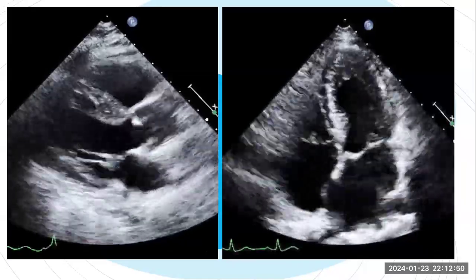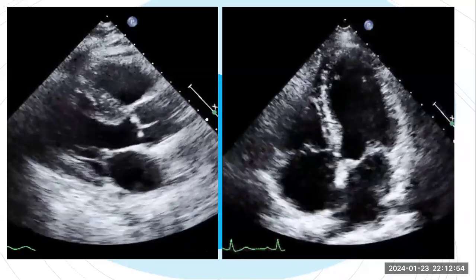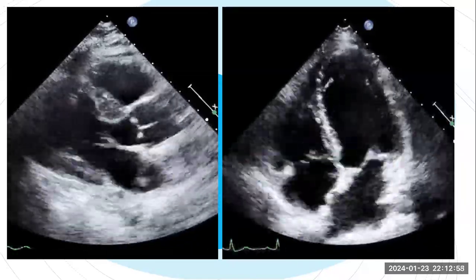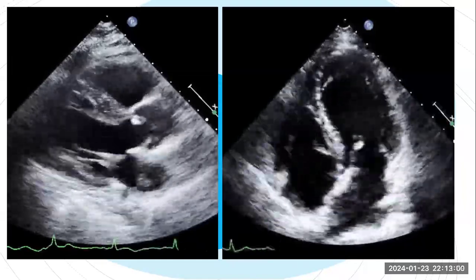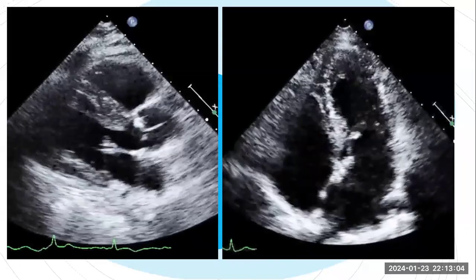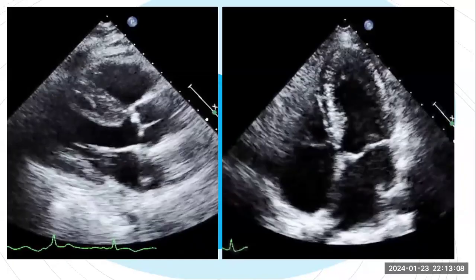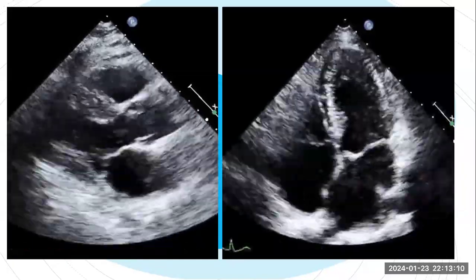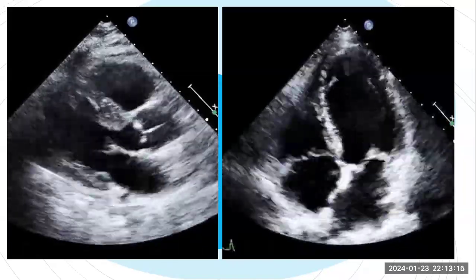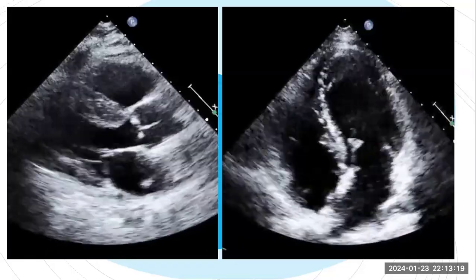Sometimes while the technician is doing the scanning, he would come and tell you that he found an RA mass. And simply after going to the apical 4, you see clearly that the interatrial septum is very aneurysmal, dancing, moving between both atria. So whenever you change your view, you can tell clearly that there are no masses, and this is just a part of the movement of the aneurysmal septum.